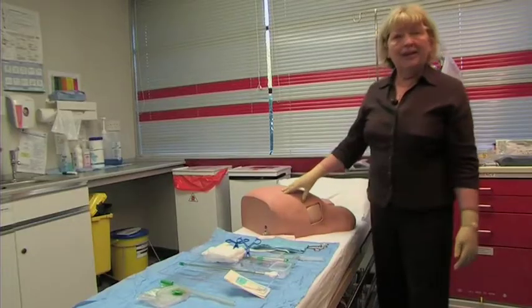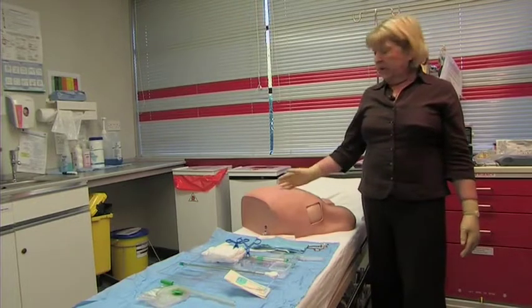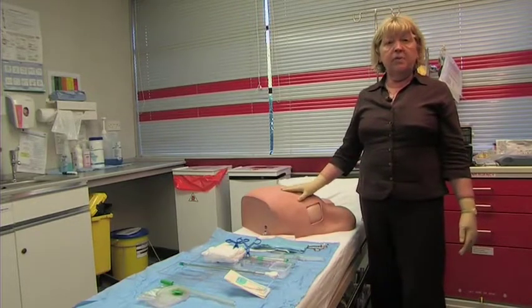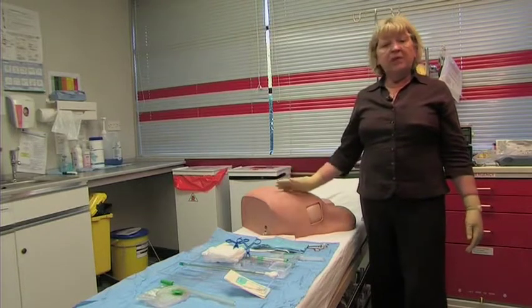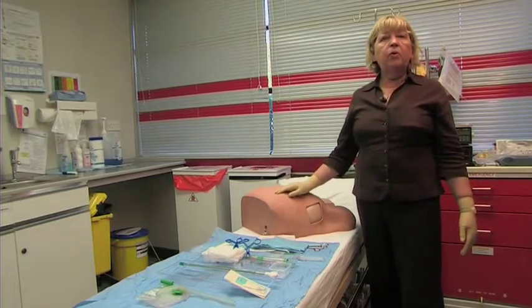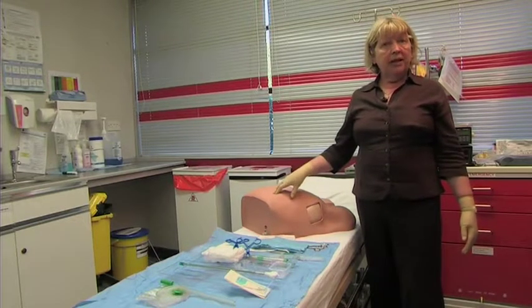Insertion of a chest drain is painful. Your medical advisor will probably suggest that you give some sort of intramuscular analgesia, and that would be given half an hour or so before the procedure to give it time to take effect.